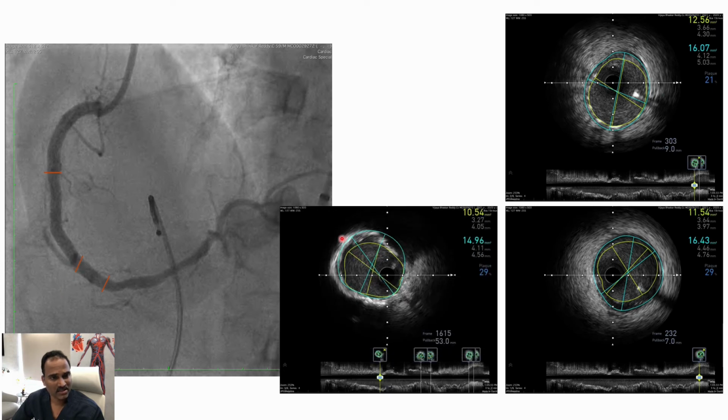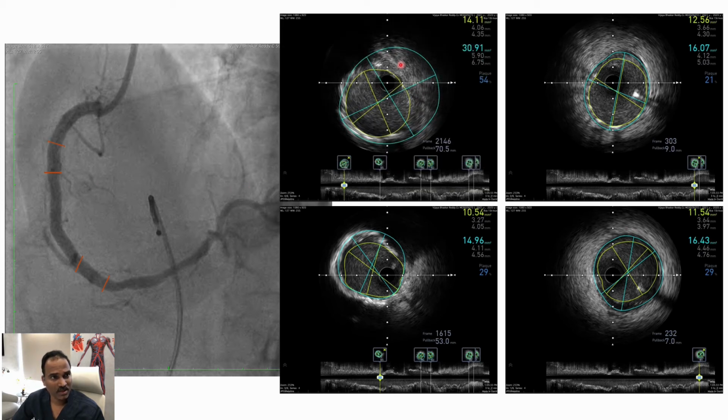And this is the MSA, the narrowest area of the stent, which is around 10.5. It's a very good area, and this is at the proximal edge of the stent, which is around 14 mm squared. So we had good luminal areas. Anything beyond 10 is, of course, where restenosis and stent thrombosis is very, very minimal, as we see even in left main coronary artery.